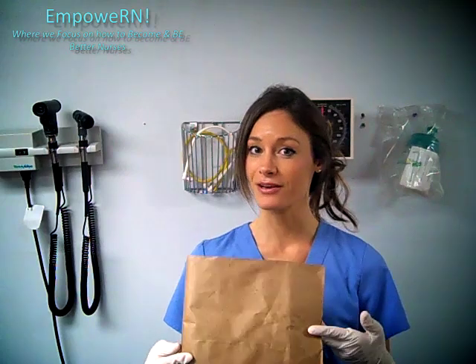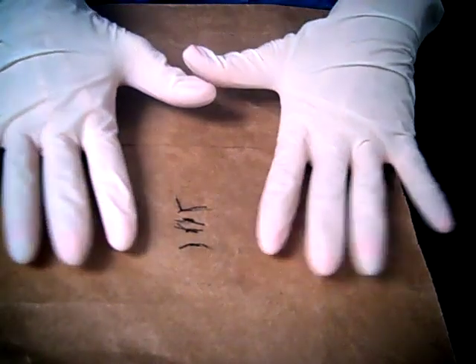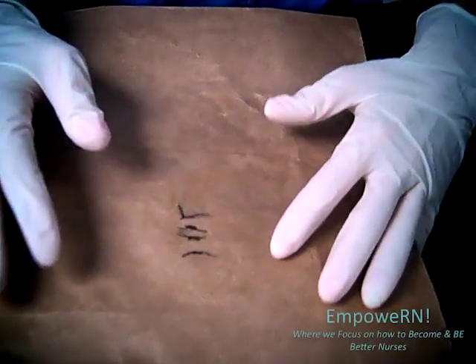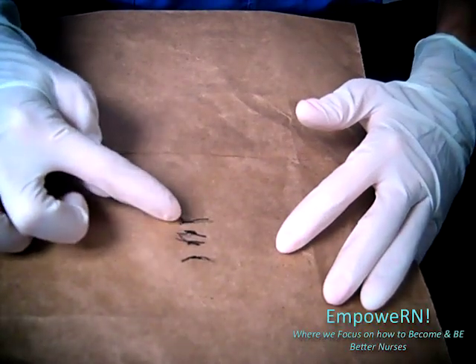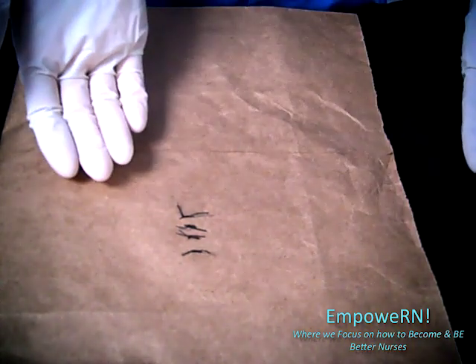Just so you know, I put it on a paper bag so you can see it a little bit better. I hope you enjoy it. Okay guys, let's get started. I put four sutures in and I made them a little bit big so hopefully you can see it clearly.